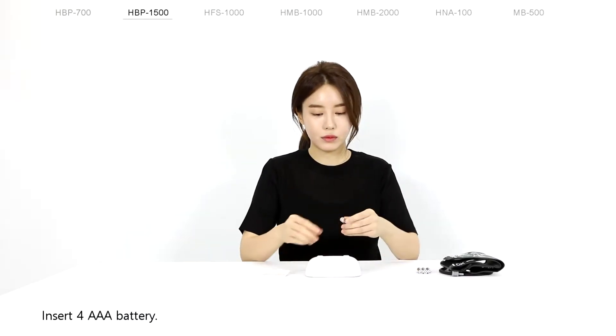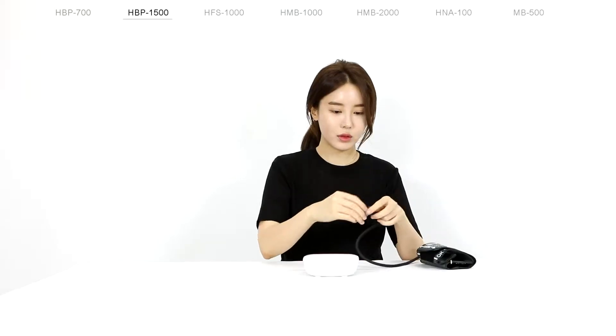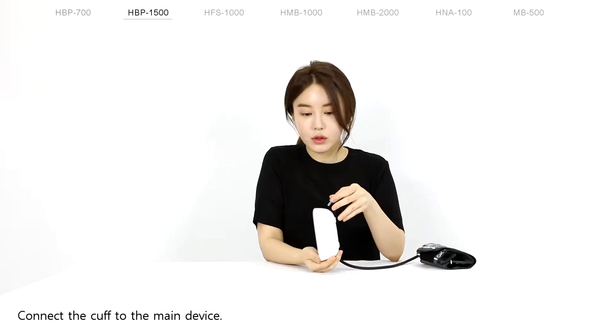Insert 4 AAA battery. Connect the cuff to the main device.